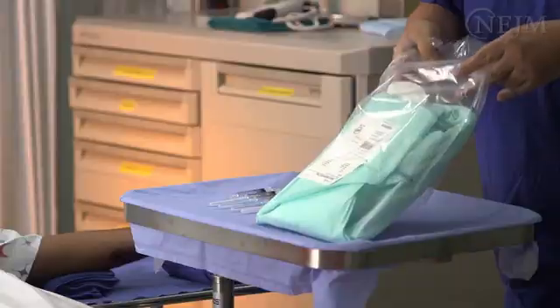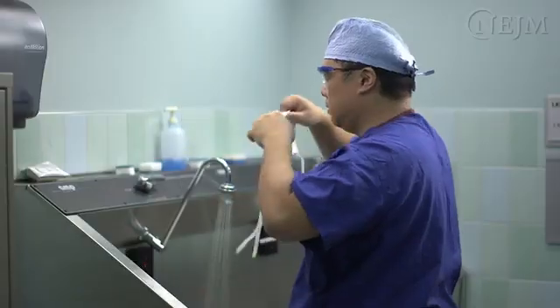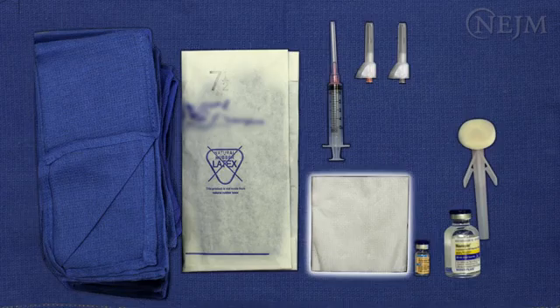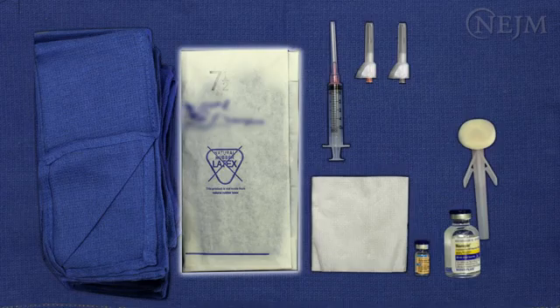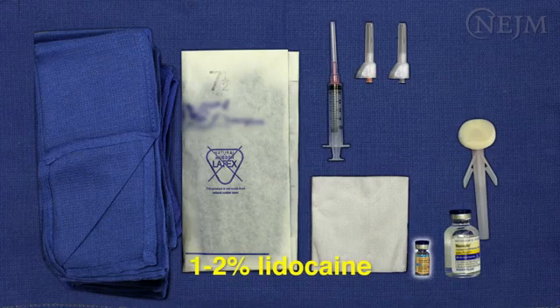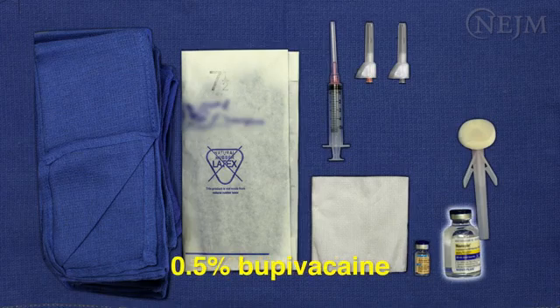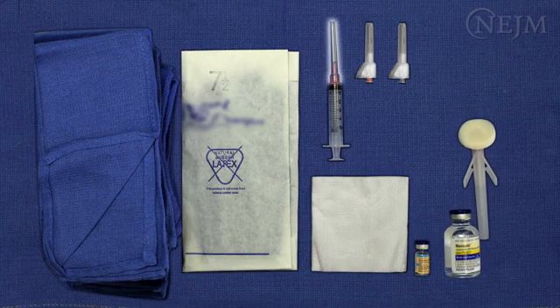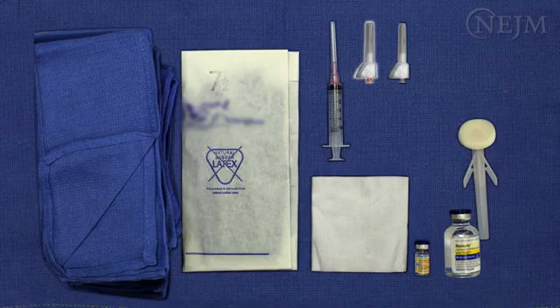Gather the necessary equipment. You will need a face shield, water, soap, a hand towel, a water-absorbent underpad, sterile and non-sterile gloves, a 10 cc control syringe, 1 to 2% lidocaine or 0.5% bupivacaine used for the wrist and not for the digital block, antiseptic solution containing chlorhexidine or povidone iodine, a 3.5 cm 18-gauge needle, and a 3.75 cm 25-gauge or 27-gauge safety needle.